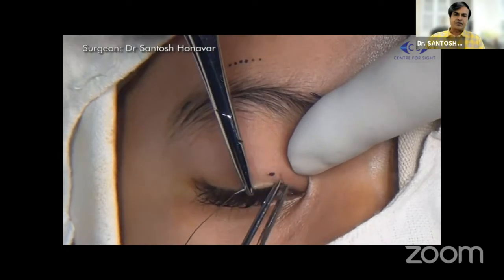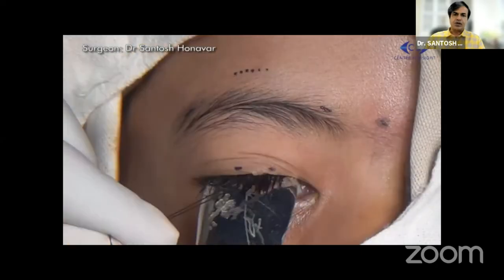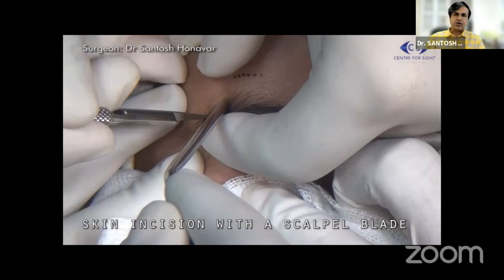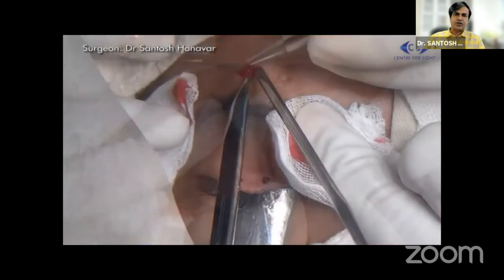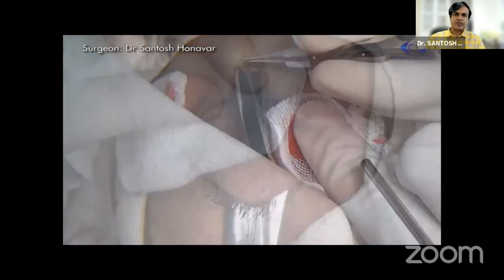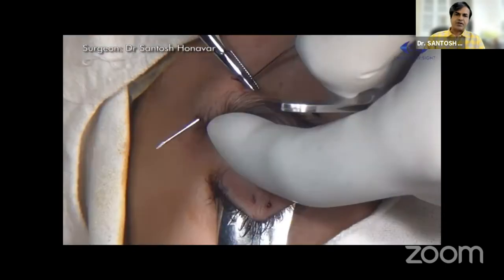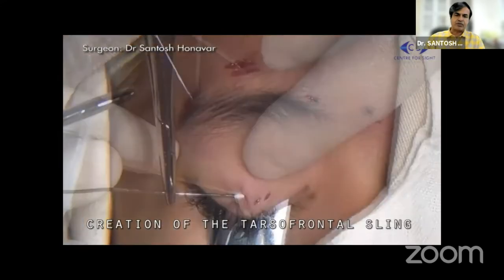I prefer to take a traction suture through the eyelid using 4-0 silk, and a lid guard or spatula is used. A small scratch incision is made in the epitarsal plane — not to injure the tarsus — and stab incisions in the medial and lateral supra-brow areas, and a central forehead incision. A pocket is made in the subcutaneous plane to bury the sling finally. The needle, which is flexible, is bent to the suitable contour and passed from the central forehead incision to the lateral supra-brow incision, making sure that there is play in it — that means you haven't caught the anterior or posterior lip of the wound.